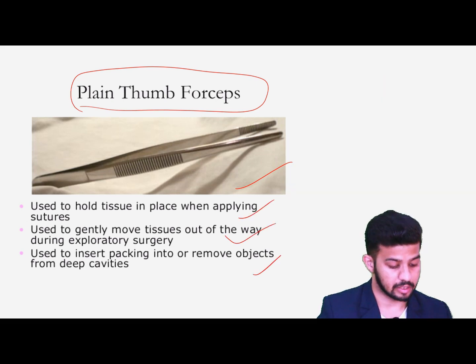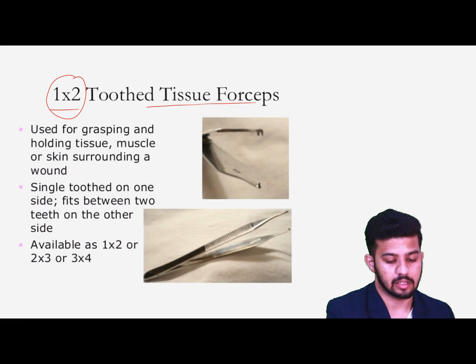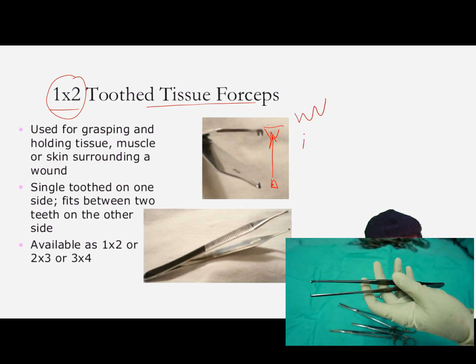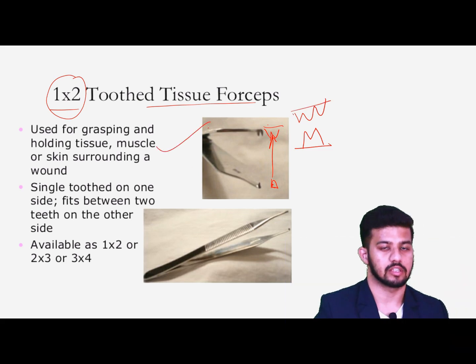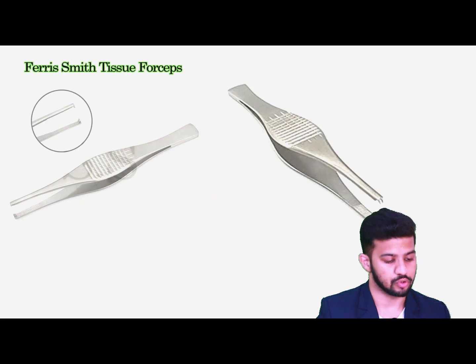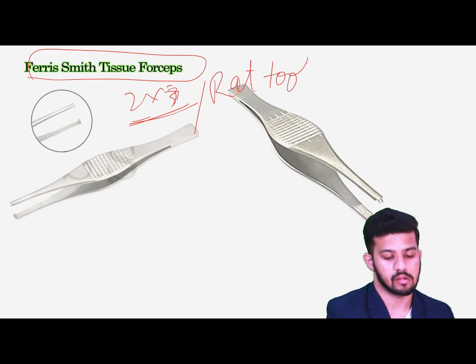We have the plain thumb forceps for holding fine, delicate structures while suturing or stitching, or removing any particles from cavities. Then we have the one-and-two tooth forceps — one tooth on one side fitting into a jaw-like structure on the other — and two-into-three tooth forceps. We also have the Ferris-Smith tooth forceps, which have a two-into-three tooth pattern — also known as rat-tooth forceps — used for holding tough structures while suturing.